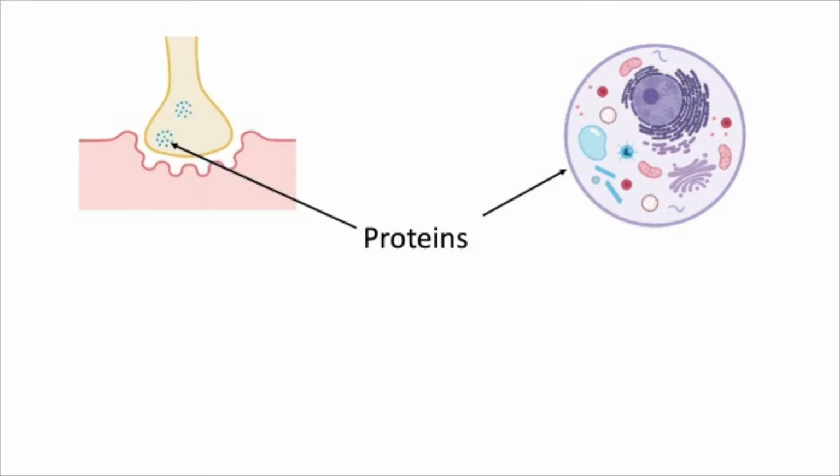One of the ways I look at changes in specific protein or gene expression is through something called in situ hybridization. This gives me an idea of activity and of how much protein is being made in a specific brain region. For those of you vaguely remembering high school biology, remember that DNA makes RNA and that makes the protein. DNA is the blueprint for everything in our bodies, namely proteins, from cell membranes to neurotransmitters to receptors.